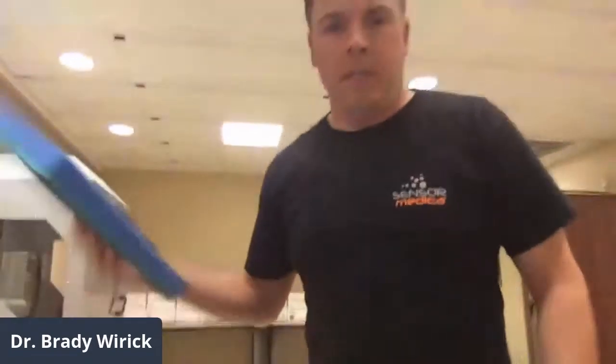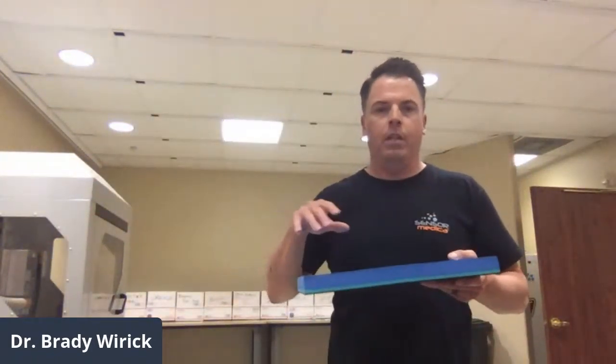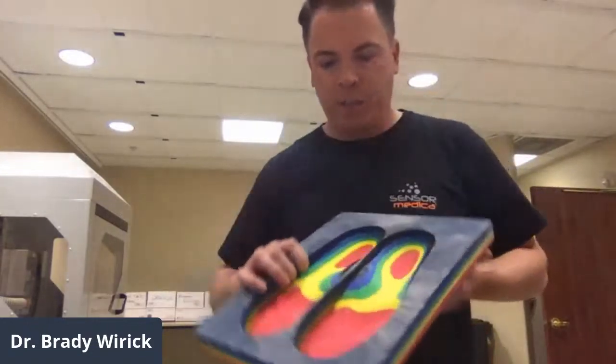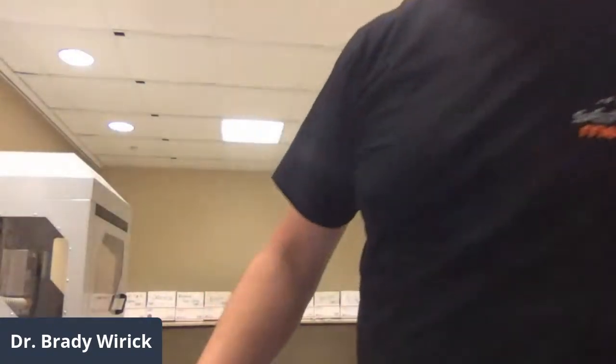a foam block such as this. The designer will choose the appropriate material based on who the patient is and what they need. They'll take this block, it will go into the CNC machine, and when it comes out it's a custom orthotic cut from that block, which is then given to the patient to help correct whatever the biomechanical issue is.